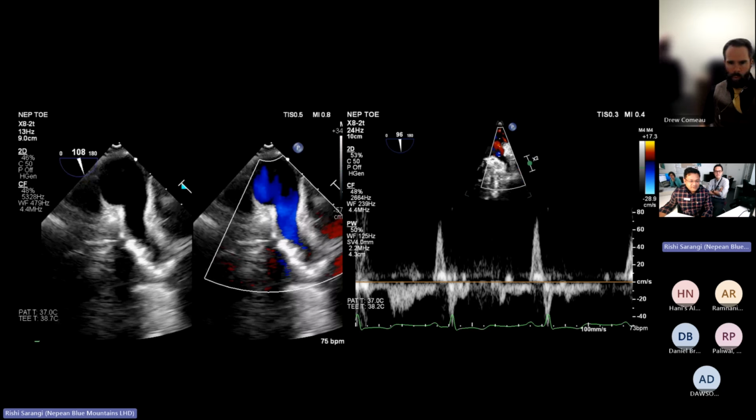But why am I getting this waveform? What is this waveform? That's an interesting one. I was expecting to see systolic flow reversal, but is that what I'm seeing? No. This is a left atrial appendage waveform. The reason is that many times when we do it in a hurry, the left atrial appendage is sitting just adjoining to it.